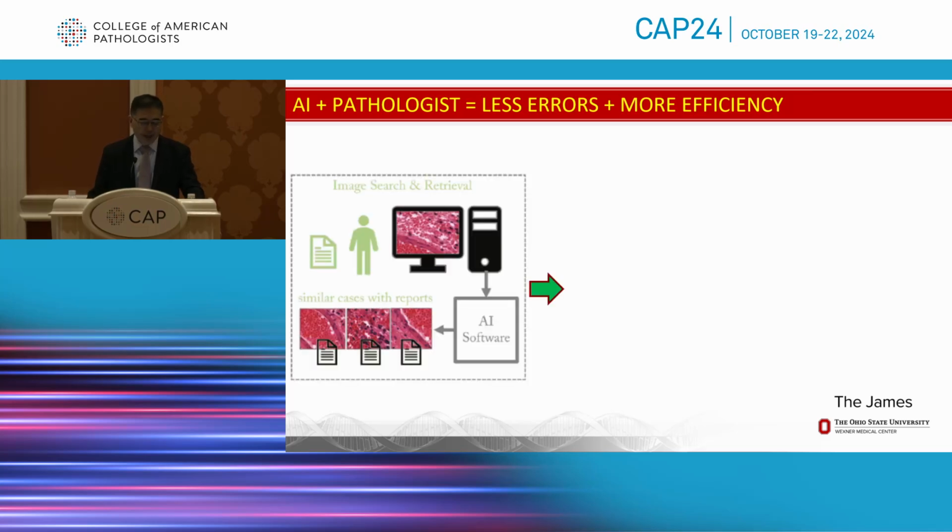So I hope this talk can help, or at least convince some of you, that AI tools are here to help us as pathologists to reduce some errors and make us more efficient, reducing the time spent either screening lymph node metastases or counting mitoses, and also give accurate results in quantification of biomarkers or even diagnosis, giving you objective results, avoiding some of those huge inter-observer variabilities.